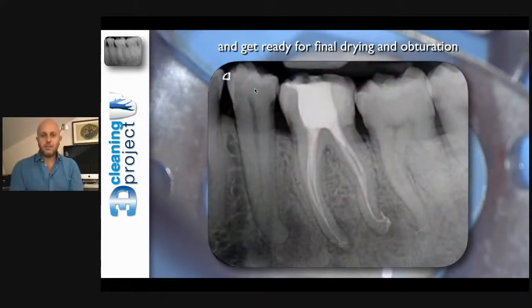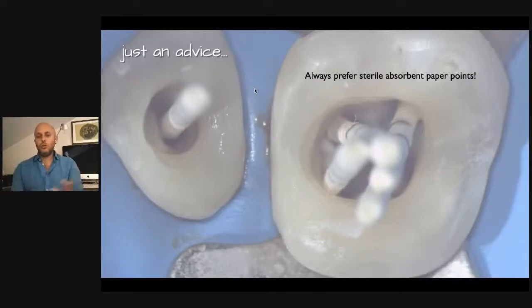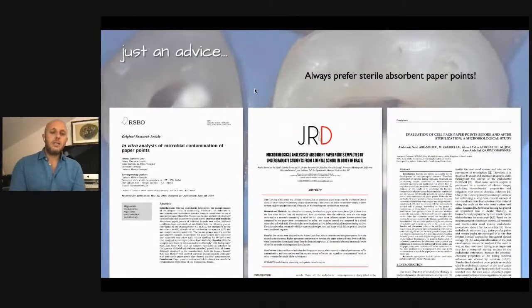And that's the result after that procedure. So, in an easy way, I shape the canals. I prefer to reduce the number of files during the shaping procedures, but I spend the major time of the treatment to improve and increase the irrigating procedures. And to conclude, just an advice: never waste your results by using non-sterilized paper points. We have so much literature showing that non-sterile paper points are filled with bacteria.